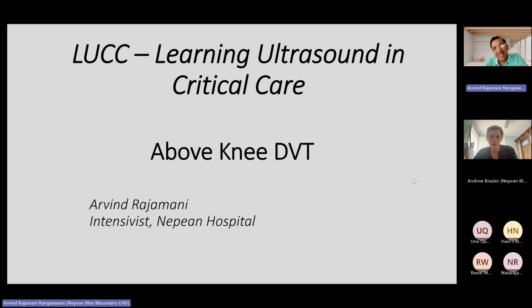All the other modalities, and maybe lung to some extent from a conceptual viewpoint, but every other modality, abdominal, including renal and biliary and vascular, are extremely easy. Vascular ultrasound is particularly easy because you do it for vascular access all the time. In this session, I'm only going to be talking about the diagnostic aspects of DVT scanning, so venous ultrasound scanning for the purpose of DVT.